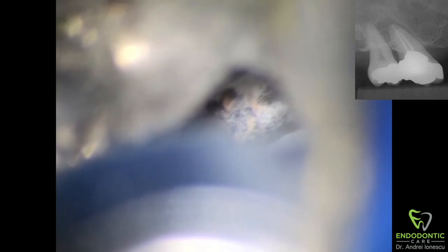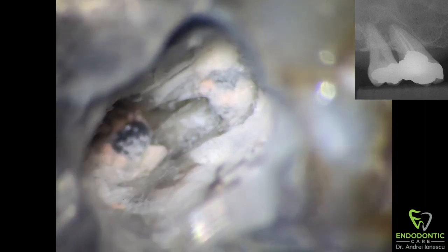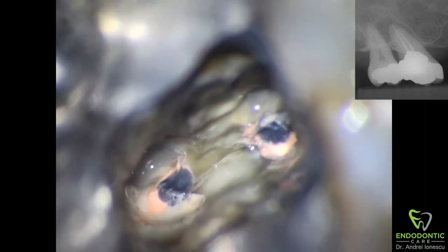This will allow us to visualize the floor of the pulp chamber, get a good sense of the anatomy, and make sure that nothing is covering our canals so we can easily remove the gutta-percha. If we pause here for a second, we can confirm that we are actually visualizing the entire pulp chamber.